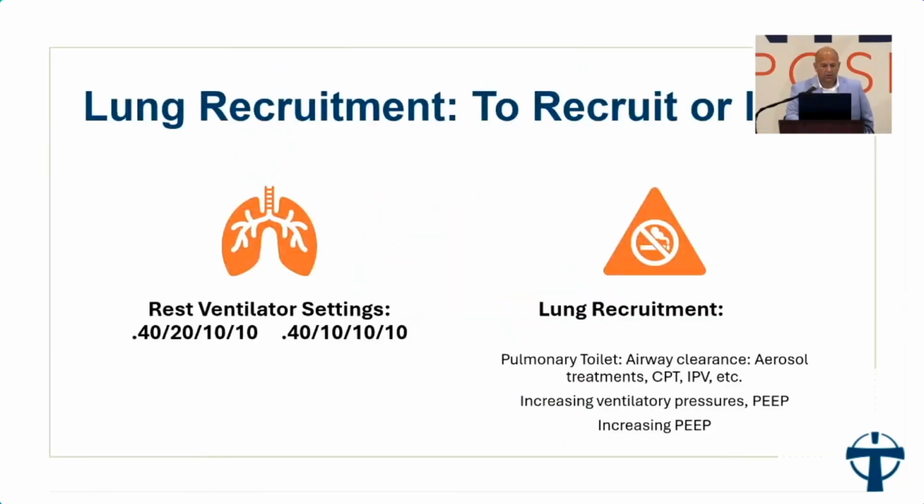One thing I want to talk about before we talk about modes is lung recruitment. Show of hands from your ECMO centers, how many of you use really strong lung recruitment to come off ECMO, as far as increasing PEEP, doing aerosol treatments, IPV, anything like that? No? Anybody do it? Yeah? Okay. Anybody do a lot of passive lung recruitment on ECMO to get your lungs better?